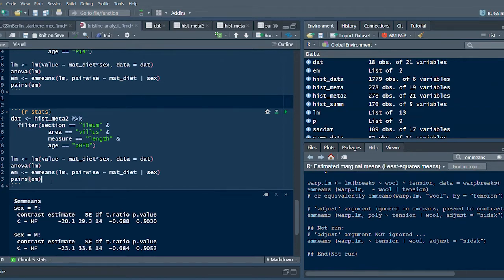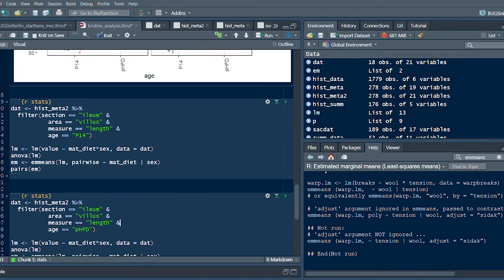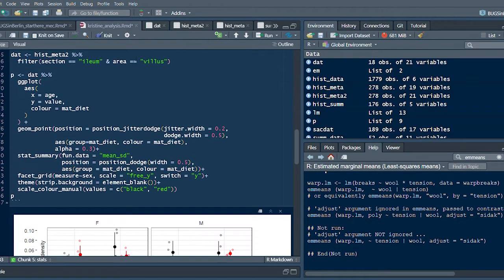There is an easier way to do this automatically, but it's a bit more complicated. So we'll cover that later. But for now, I think that it's fastest to go through it this way versus trying to figure out the automated way to do it. So we could also look and see if there is something that we expect there to be a difference for. It doesn't really look like any of these are super different, but maybe if we look at, what did you say was different?